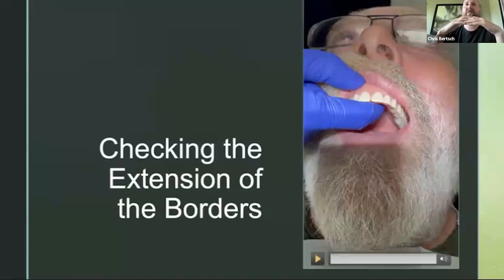I find that with digital dentures, after we extract the teeth and everything heals at this 3-month mark, it's rare that it's overextended. And it's rare that a patient comes back because it's overextended. And I find it's just because it captures the vestibule really nicely and then leaves space for that reline. And then, yeah, I just keep repeating this process until the denture isn't moving in his mouth before we proceed.